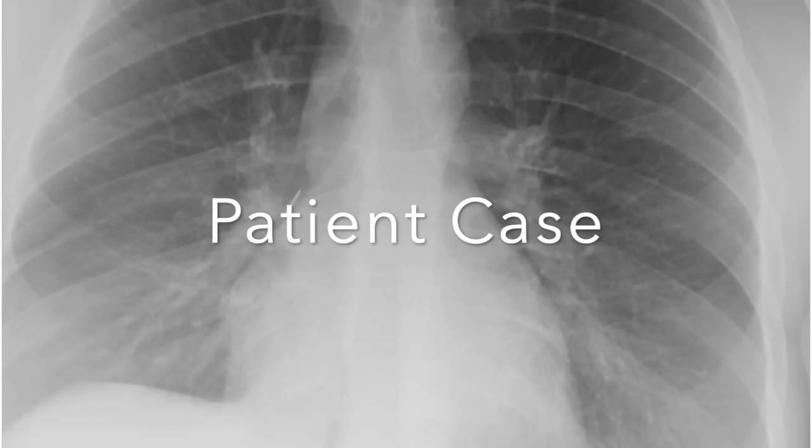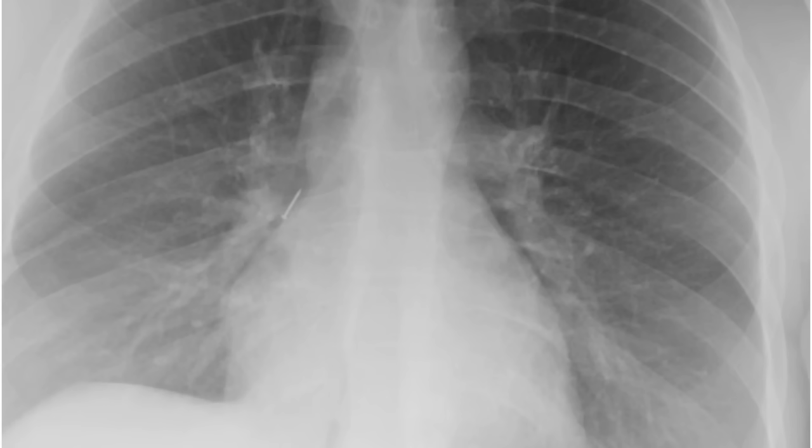We are now going to review bronchoscopic footage from an actual patient who accidentally swallowed a pushpin. The pushpin was seen on chest x-ray to be located in either the right bronchus intermedius or in the right lower lobe.